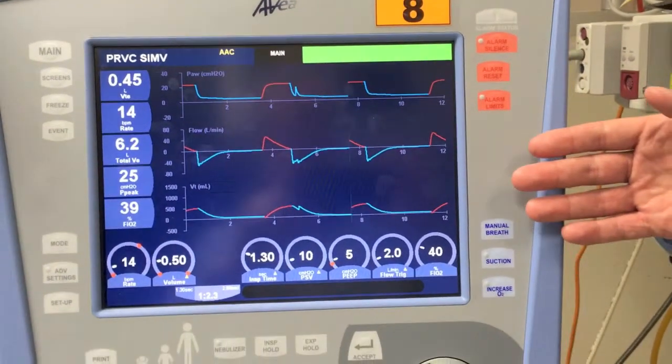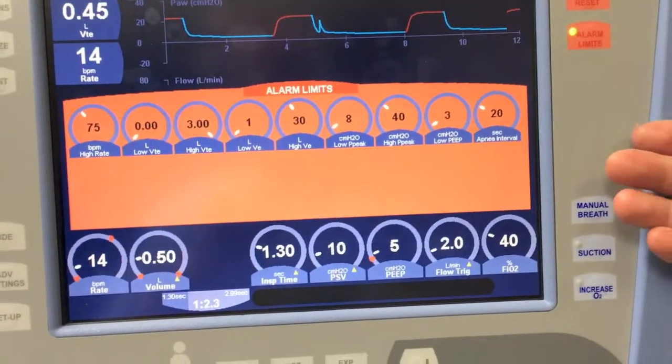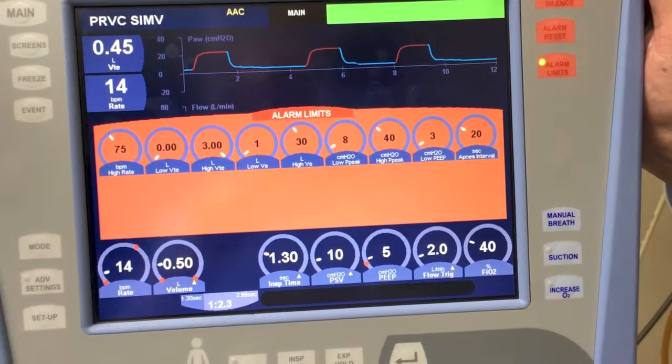Something else that we need to check on this ventilator at the start of every shift is our alarm limits. We must be careful, because the default alarm limits, as you can see, are very wide on this ventilator. It's important they're changed to an appropriate level for your patient.